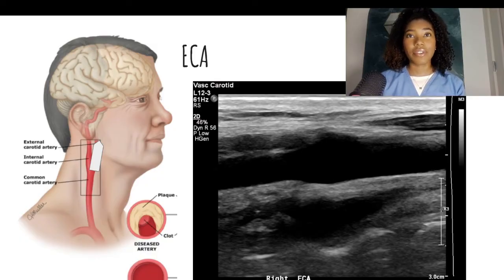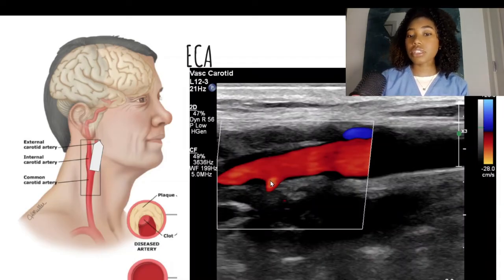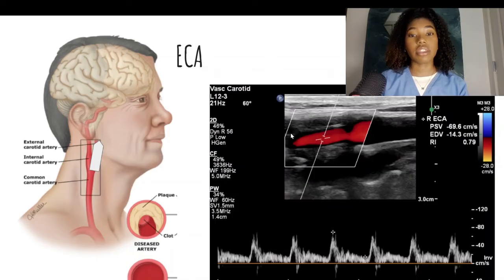Next, let's move on to the ECA. We will be moving a little bit proximally on the neck but still on the upper part of the neck. This time you'll be angled towards the face. You want to make sure that you are on the vessel with branches coming off of it — this will be the narrower of the two bifurcating vessels, generally speaking. To make sure you are on the correct vessel, you can Doppler it and confirm you are getting the high resistive flow. So you will take the 2D image, then the color Doppler image — here you can see the beginning of a branch coming off my ECA — then the pulse wave.